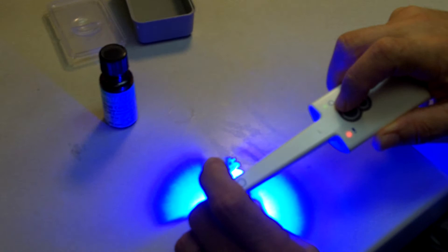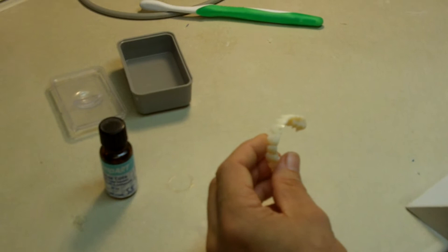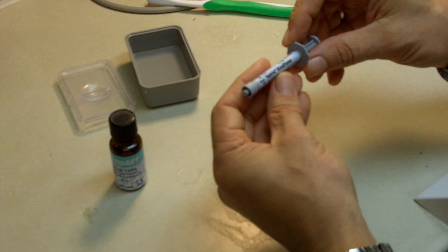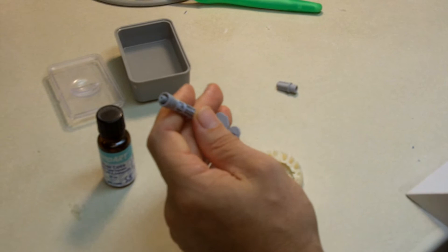And then I'm going to add the flowable composite of choice. In this case, it's going to be some Tetric EvoFlow XL, and it's white. The color is extra light.